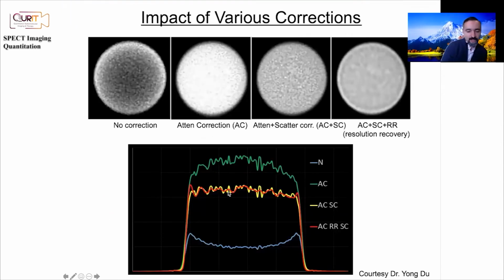Again, showing you the fact that if you're doing no correction, you get this sort of a dip. And then when you do attenuation correction, suddenly this weirdness appears, and sometimes it may almost be a hurdle. You're like, wow, I tried to correct this, but it didn't work out, but it did work out. You got rid of the attenuation problem.